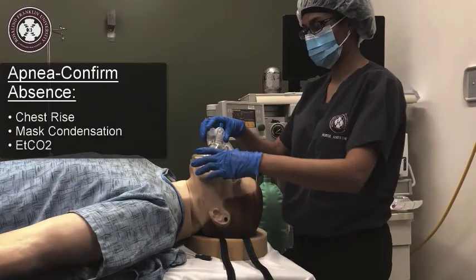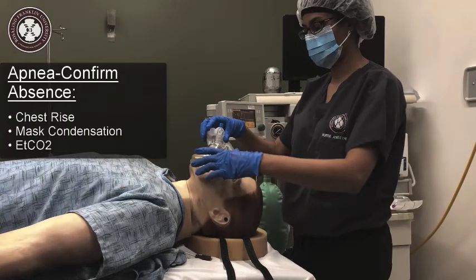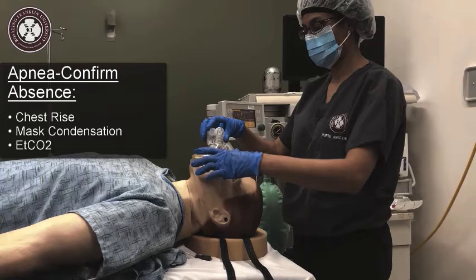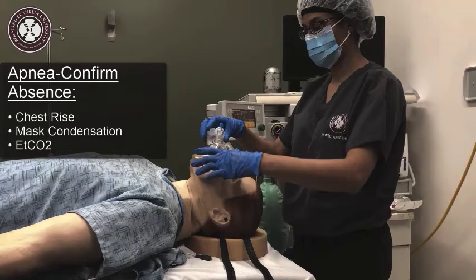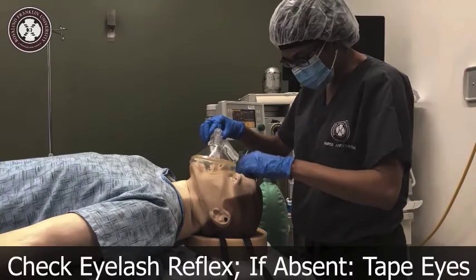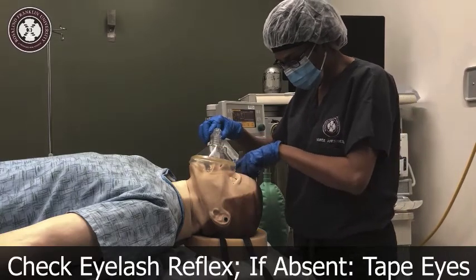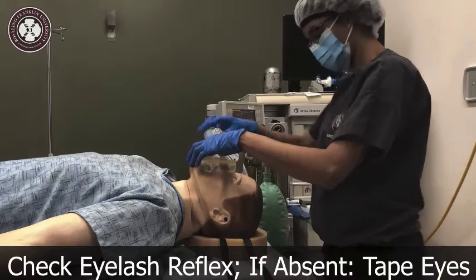Anesthesia induction is first confirmed by apnea. Look for an absence of chest rise, mask condensation, and end-tidal CO2. Then assess the eyelash reflex. If absent, tape the eyes closed to avoid a corneal abrasion.